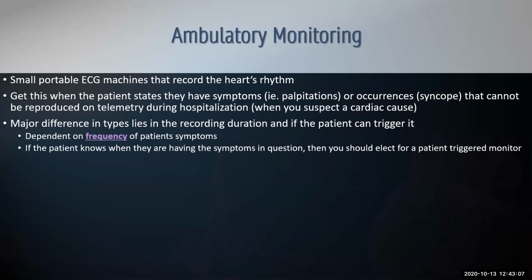The times we're going to do it is for syncope, palpitations, or when you suspect there's a cardiac cause for symptoms, but we're just not capturing it during the hospitalization.